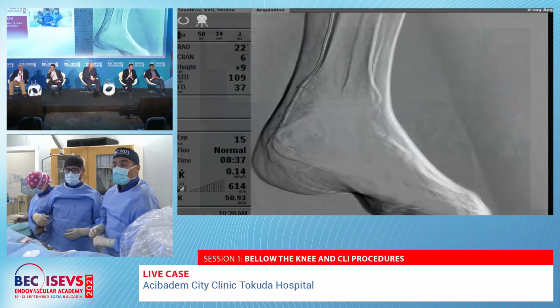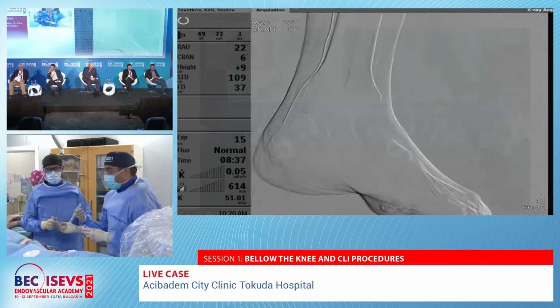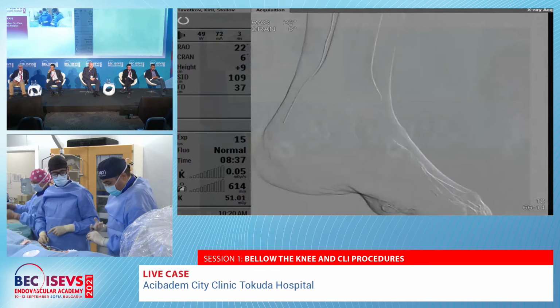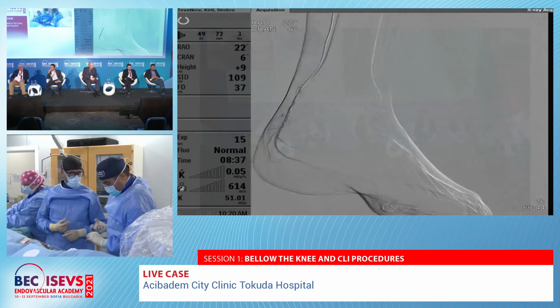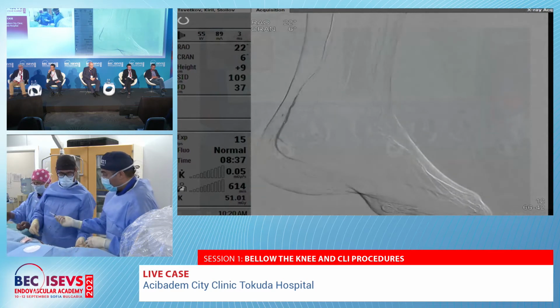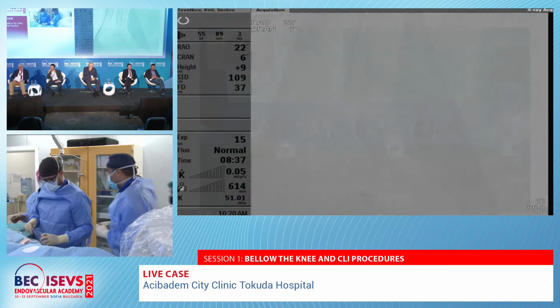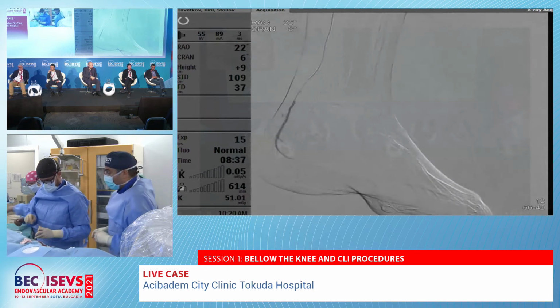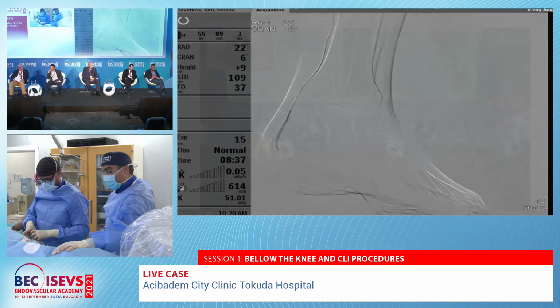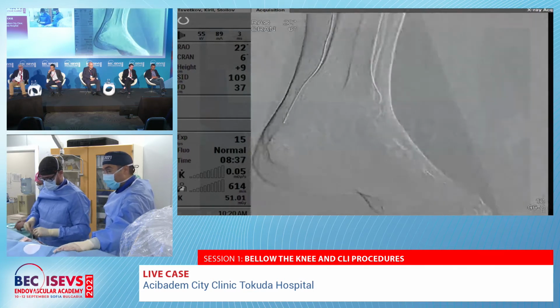Okay. Yeah, it looks good. You're definitely in. So, command 14. We have small. Perfect. Here you are. What is your workhorse wires? I mean, I really like the command wires, 18 and 14.